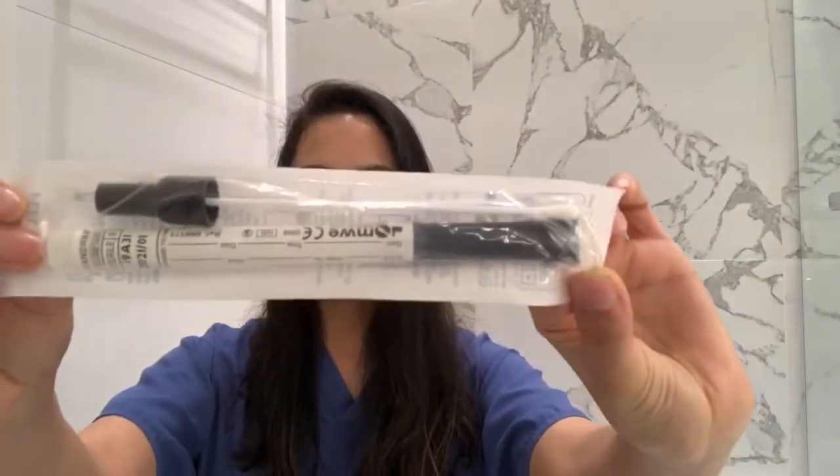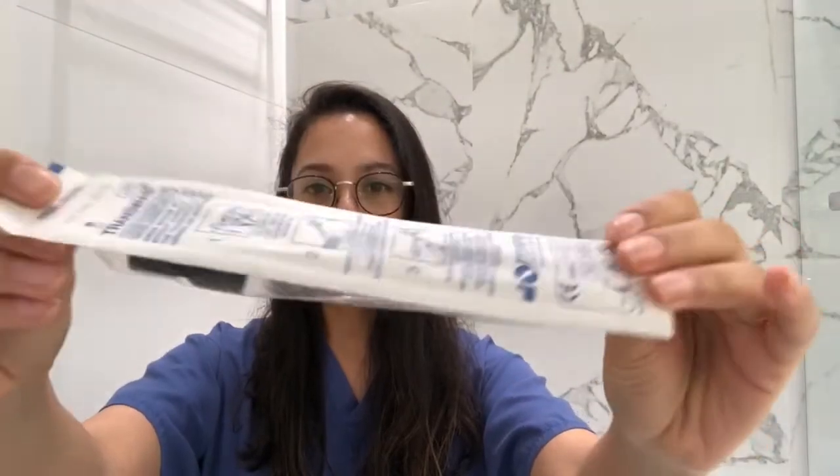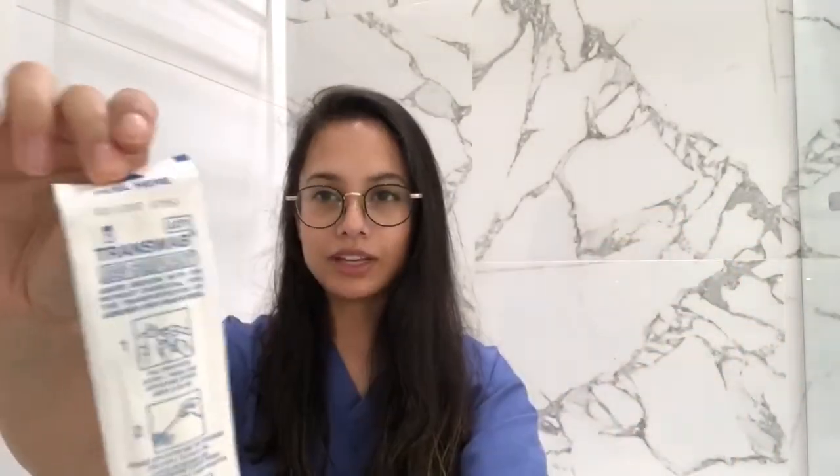This is one of the common swabs that you might be asked to use. To start with, you can see the peel here sign.